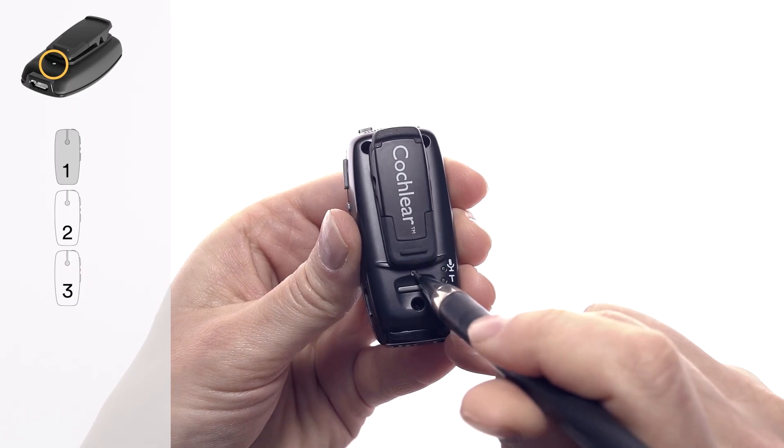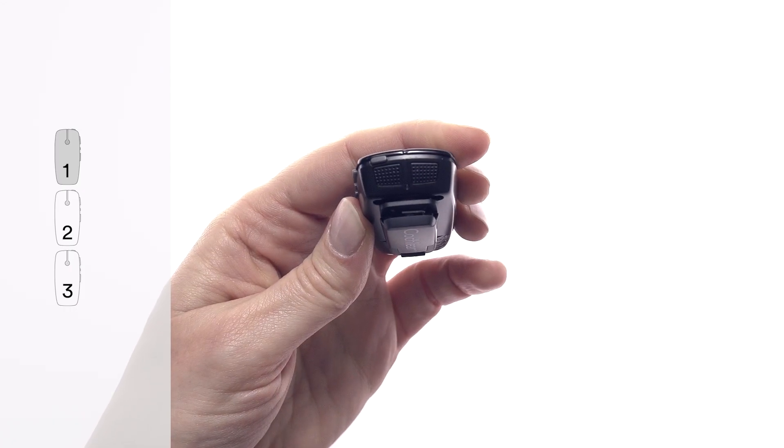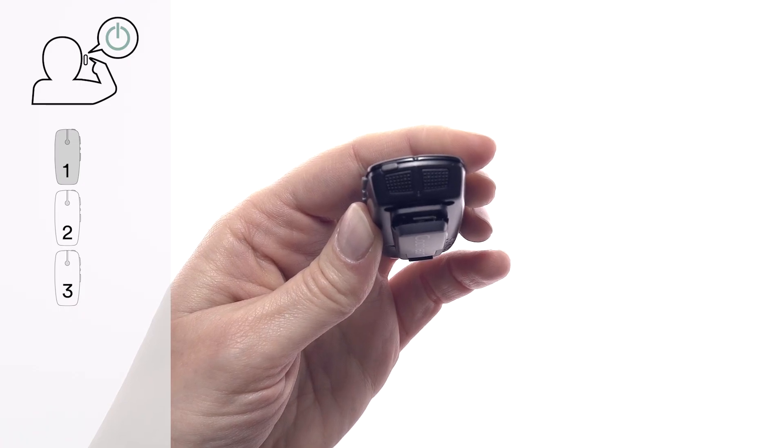Use a pen to press the pairing button once. The LED on top of the mini microphone blinks yellow once every 2 seconds for 20 seconds. You must turn on your processor during this 20-second window to pair it with the mini microphone.